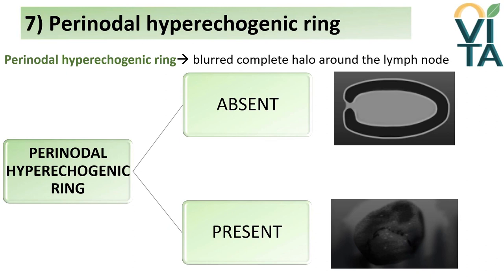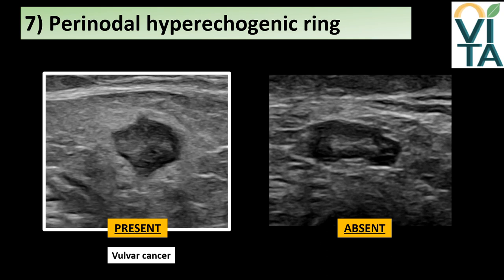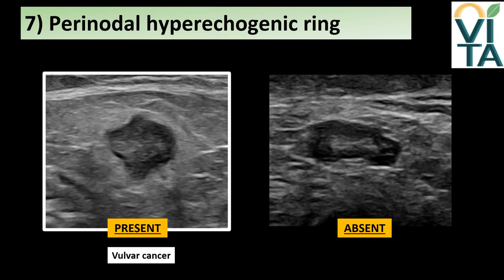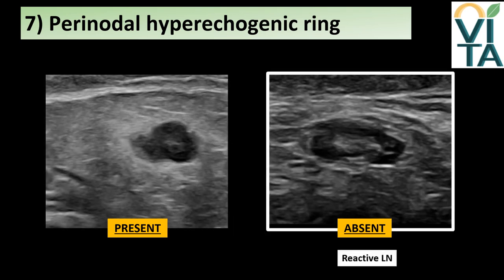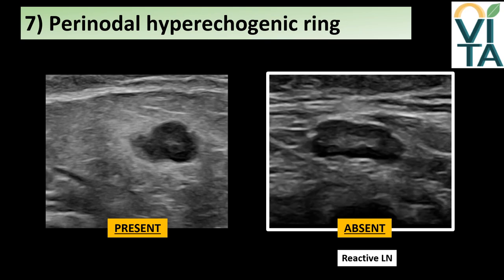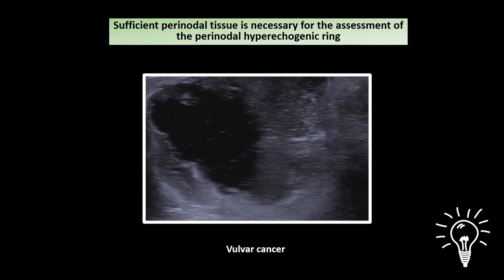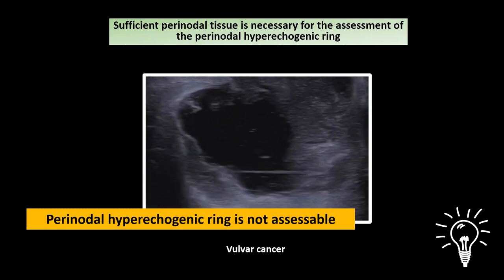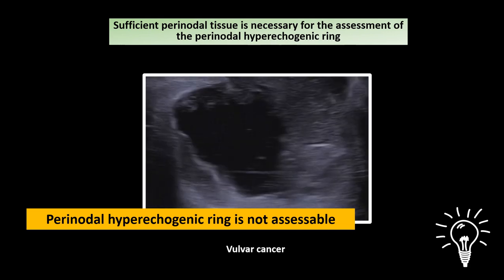A hyperechogenic ring is defined as a complete, blurred, thick halo around the lymph node, caused by desmoplastic perinodal tissue reaction around an infiltrated lymph node. It should be reported as present or absent. In videos from a vulvar cancer patient, a complete hyperechogenic halo with blurred underlying tissue around the lymph node is visible, while more distant perinodal tissue has normal appearance. On the right, a normal lymph node is surrounded by sharply demarcated hyperechogenic septa. To describe the perinodal hyperechogenic ring, sufficient perinodal tissue must be viewable — if not, it is defined as not accessible.